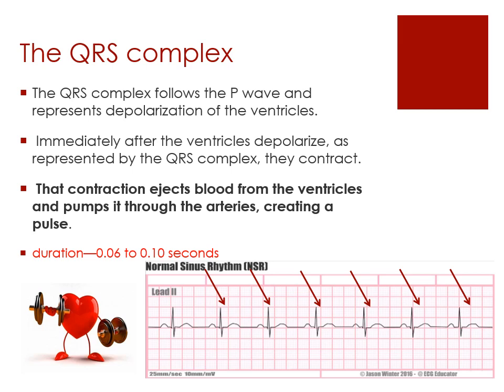The QRS complex is when the ventricles contract. Now remember, the ventricles are a bigger muscle, so it's going to cause a bigger spike. That's why you see that big spike there. So that's the contraction that ejects the blood from the ventricles and sends it into the semilunar valves, which is going to be the pulmonary artery and the aorta. Notice it's a very quick pump, but that's because it's a bigger muscle. So of course it's going to pump much quicker and much more forcefully to get that blood where it needs to go.